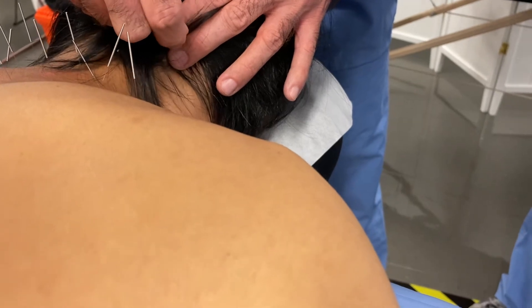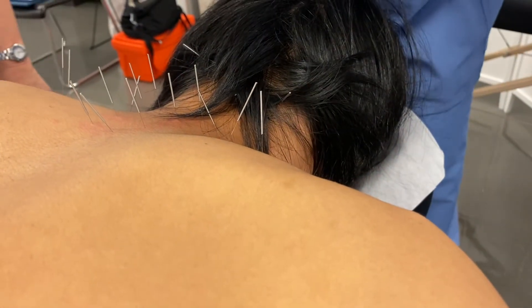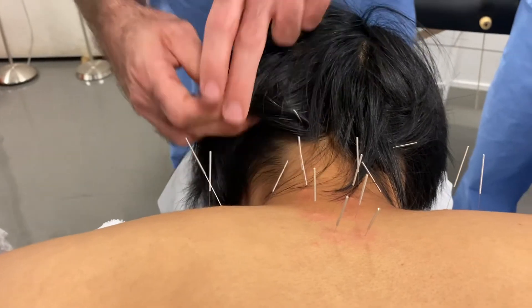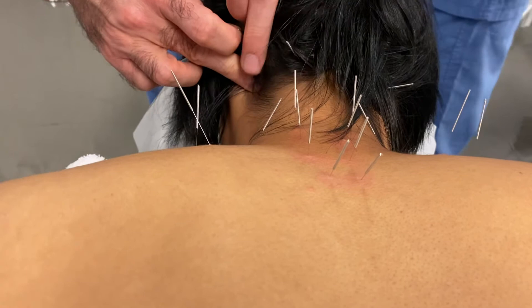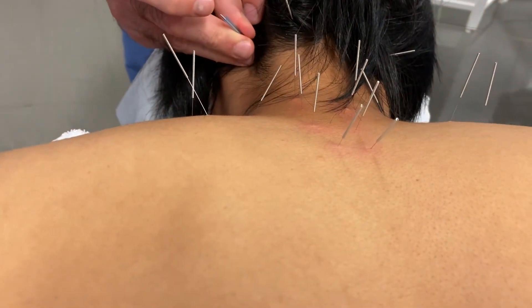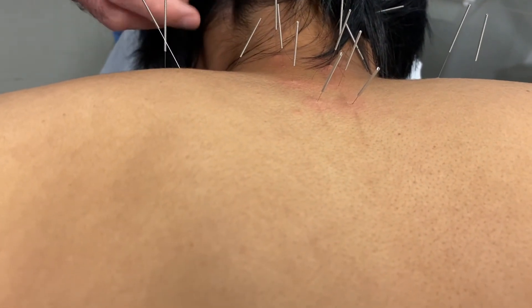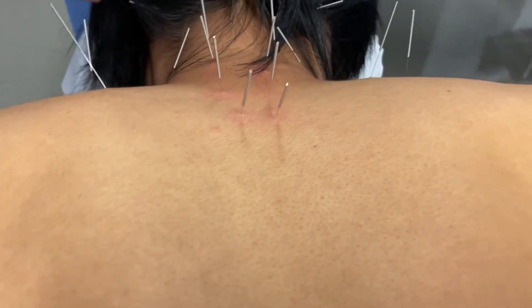Splenius capitis motor point. Okay, same on this side. I think that's all of them.